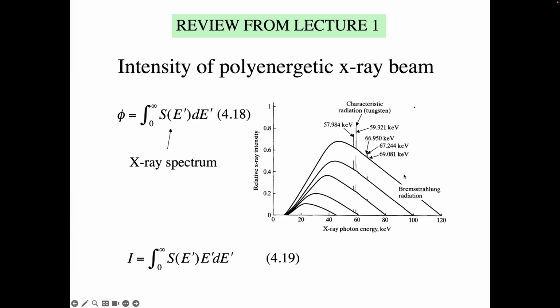And so it just got bigger and bigger and bigger in terms of the X-ray dynamics. And here we'll recall from lecture about X-ray physics that the source, right, has some kind of spectrum, right? So this is the density of X-rays as a function of energy, right? And this helps create a specific look of images from a different manufacturer. They'll change this spectrum with filtering and stuff like that, make it harder, make it softer. And you can see the difference in different manufacturers, say between a Canon scanner and a Siemens scanner.